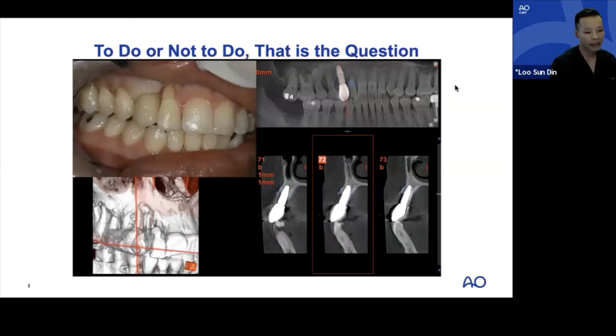There are many, many ways to rebuild or at least try to re-architecture the missing components. The first and foremost is guided bone regeneration using barrier control, where a membrane of some sort maintains space with or without recombinant human bone morphogenetic protein. Second, we have onlay bone graft, where we take a block of bone from the chin, ramus, or hip.